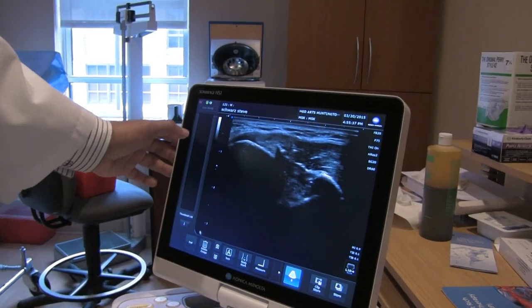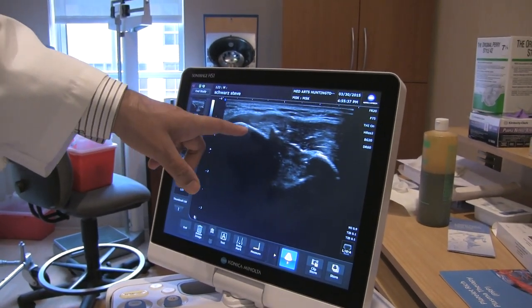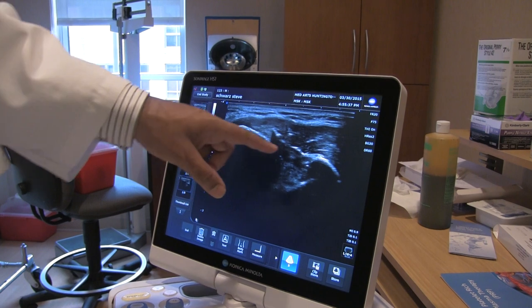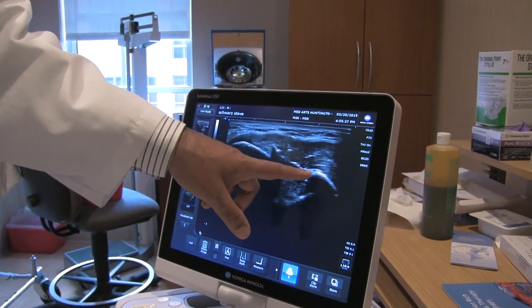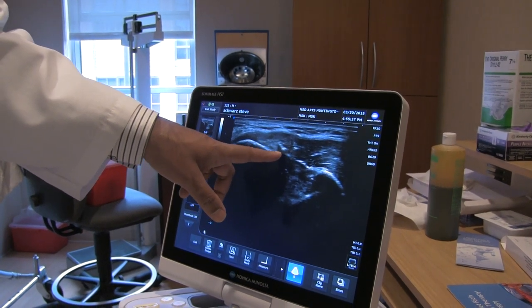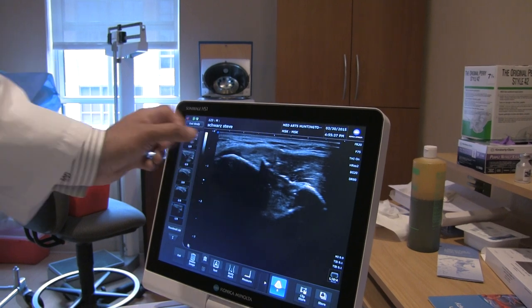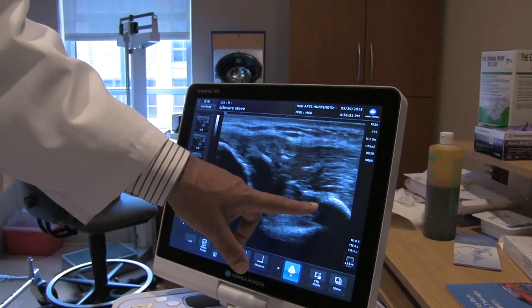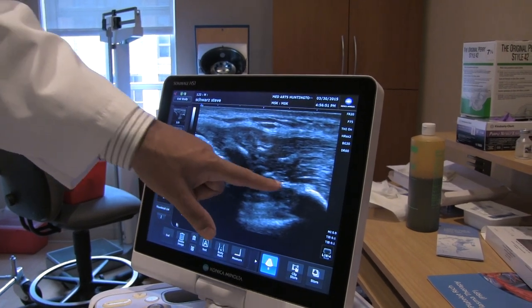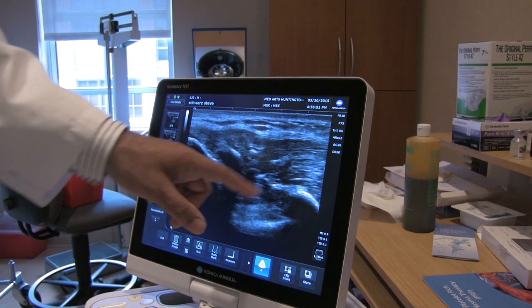These two bones here — this right here is the ulnar collateral ligament complex. You have the ulna and you have the medial epicondyle. Between the two is something called the anterior bundle of the ulnar collateral ligament complex. And that's calcified right there. There's some calcification along the UCL. You can see right there — it's a great picture. There's the injured UCL ligament. It should be a nice thin line. It should not be calcified.